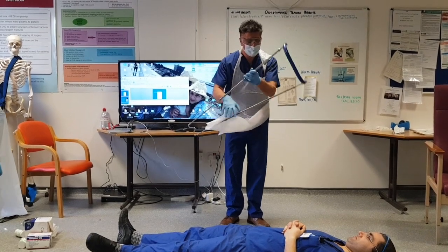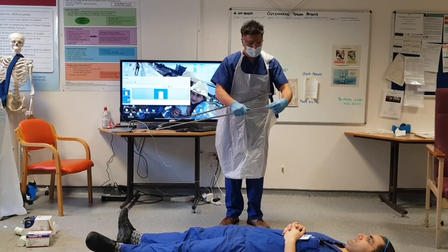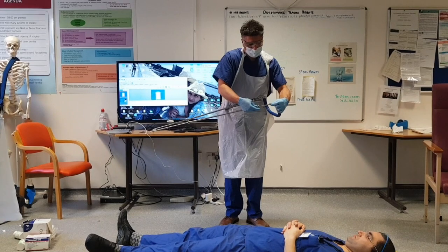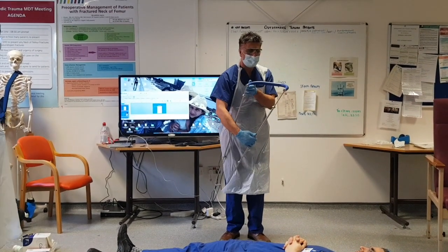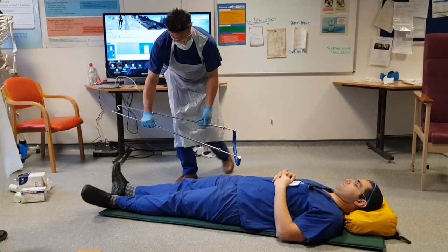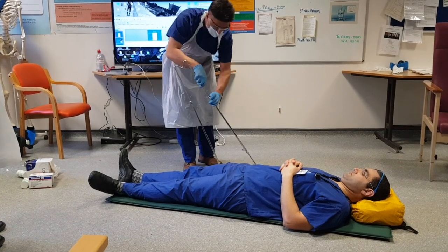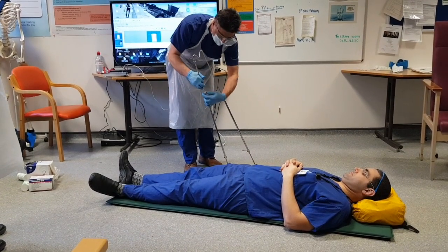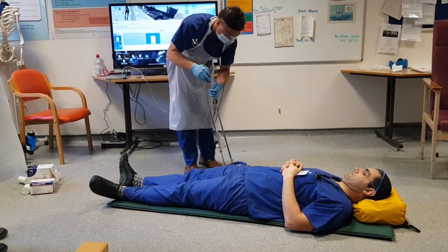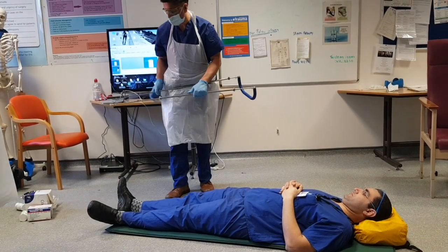We need to make sure that we've got all the right equipment. You want this to be appropriate for the left-hand side, so I'm going to press the button on here and lengthen it. And that is now appropriate for the left-hand side. We want to make sure we can measure it on his other leg just to make sure that it's going to be long enough. It's telescopic, so I think that's going to be long enough for us.